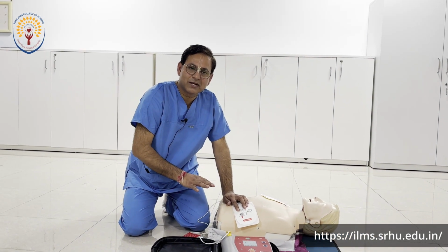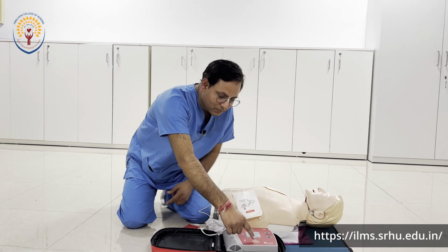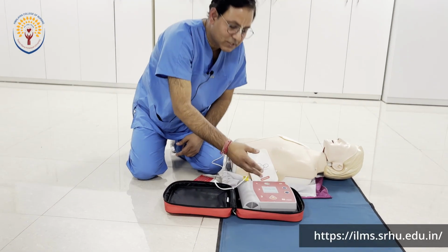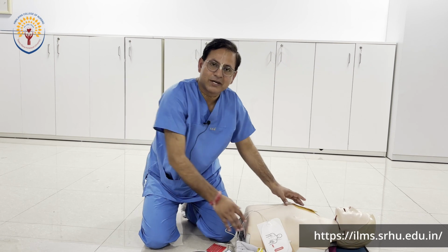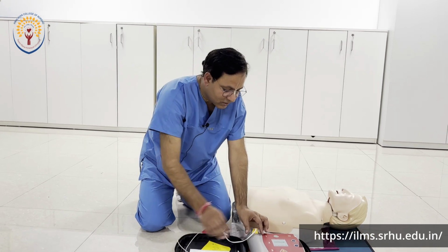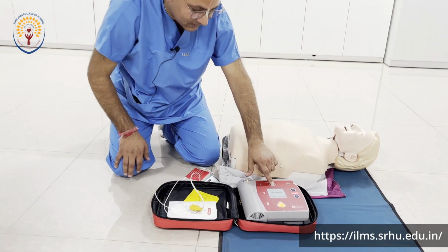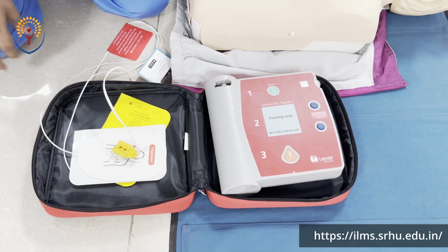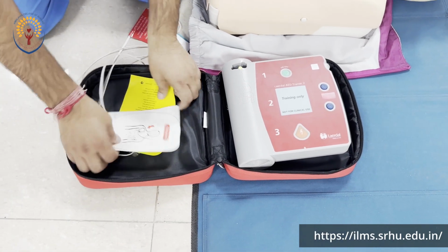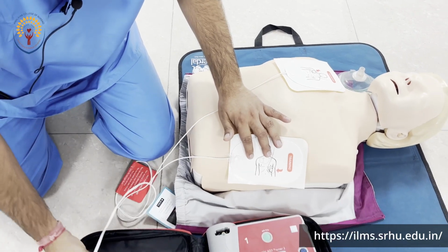After making the statement, I clear, you all clear, we press this button, and it will say shock has been delivered and you can resume the CPR. Once I will show you the demonstration of how this machine actually works. So I am turning it on. Apply pads to patient's bare chest. Plug in pads connector next to flashing light.